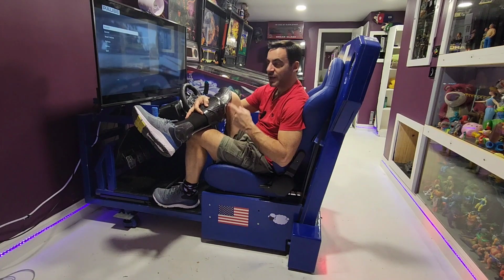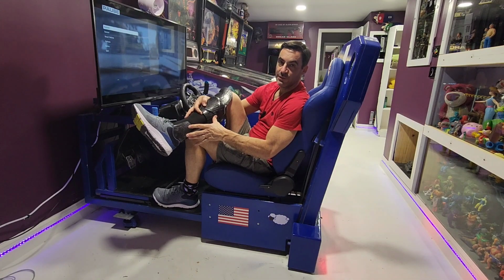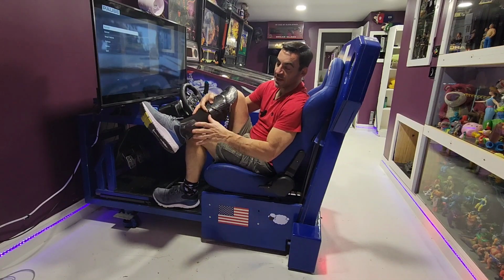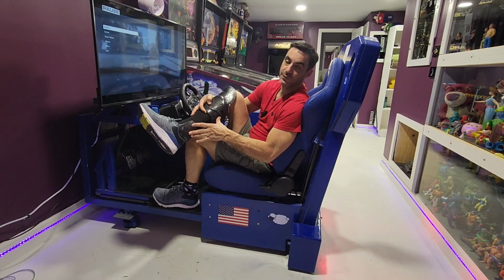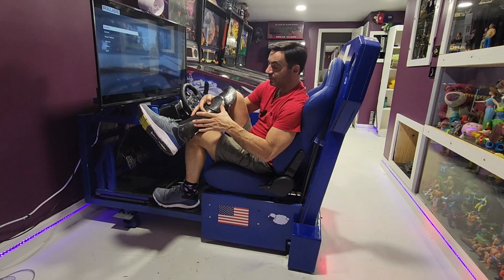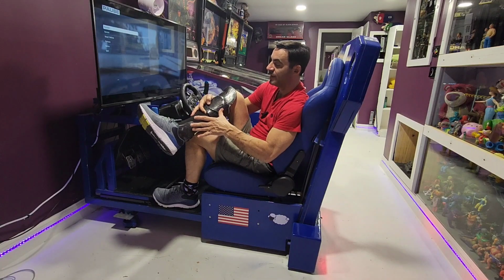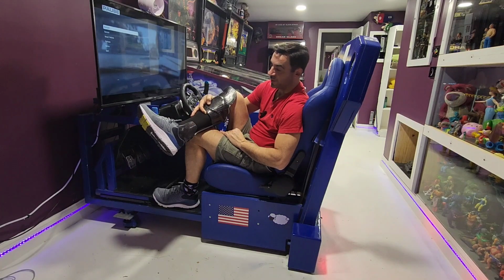But I'd be interested to know if there's anybody else that's in this type of boot. Apparently, this type of brace was developed for a US soldier that stepped on an IED and destroyed his ankle. And this kind of thing was invented and developed for him so he could walk using his own leg, so they didn't have to amputate. I've never seen anybody else walking around in one of these. I'm sure there's thousands of people that have got them already. Be interested to know if anybody is in sim racing and they've got this kind of appliance and how they get on with it. But I think for the real world, I'll definitely be taking the thing off.